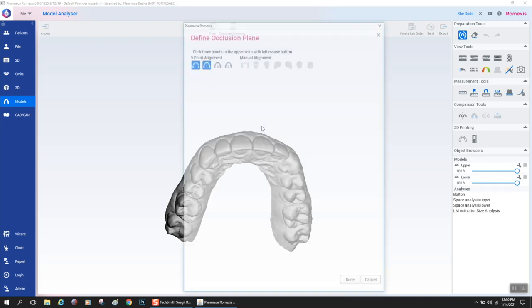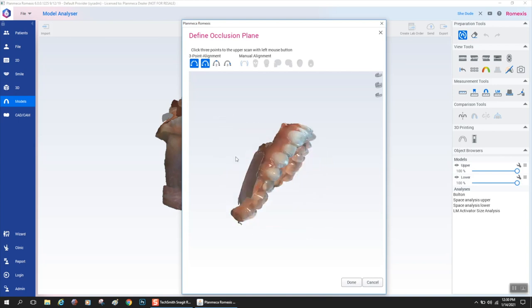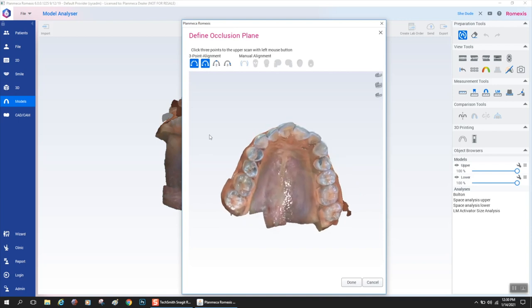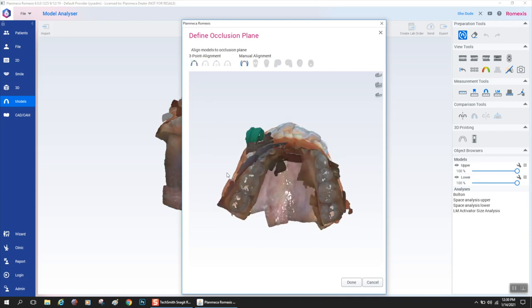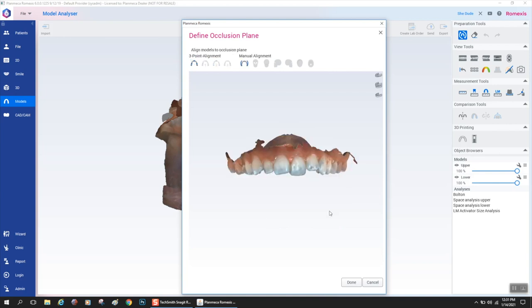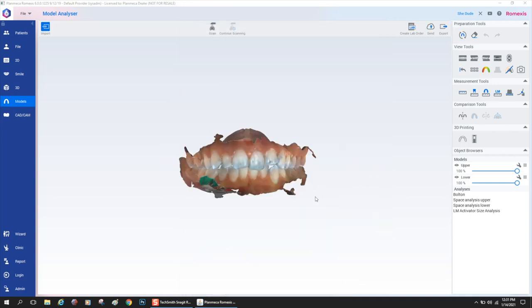The first thing that the software asks you to do is select the model orientation, basically defining the occlusal plane. I like to select the three points. Default is selected on. You could turn off your lower by selecting the lower model. I click my molar cusp tip, my central incisor edge, and my contralateral molar cusp tip. And that's it. You'll see when I turn on the lower, you got a nice occlusal plane.